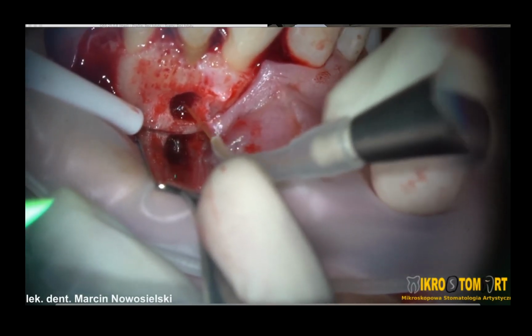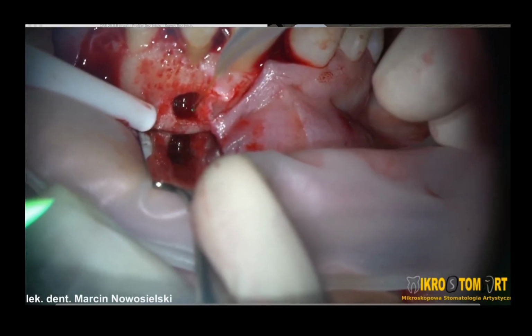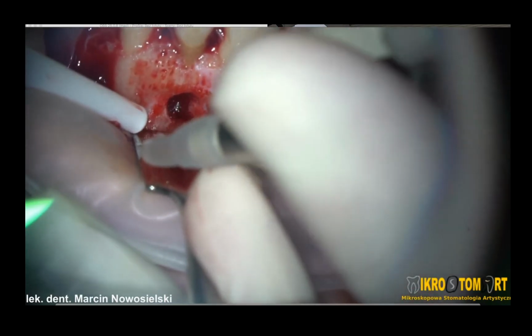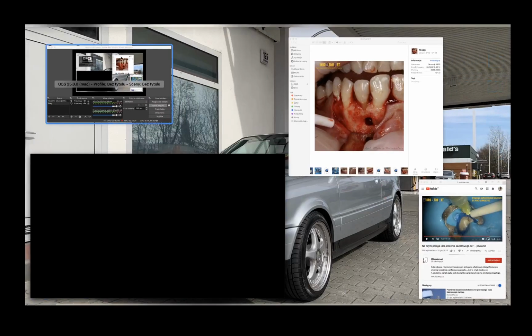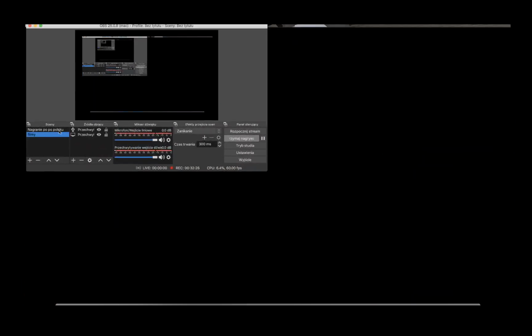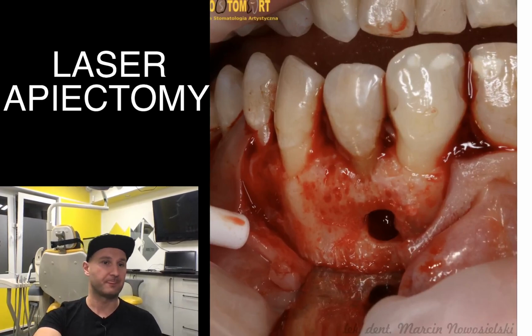So this is one of the things that this 1064 light causes. And the other thing is anti-inflammatory and analgesic effect. So it is very important for the patient, because it causes them to heal better.